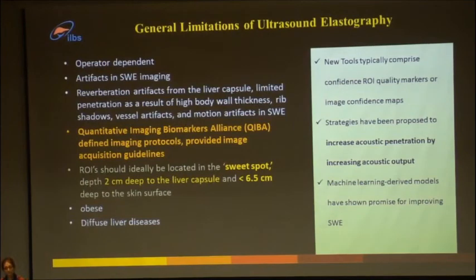So what are the limitations of ultrasound elastography? We saw it's very good. It's a very good modality. It's again operator dependent. There are artifacts from the liver capsule and from the body wall thickness. All these parameters will lead to limitations of elastography.